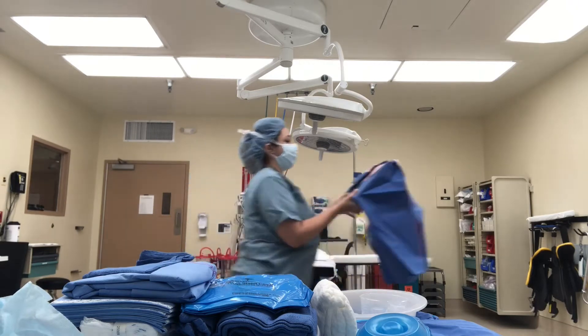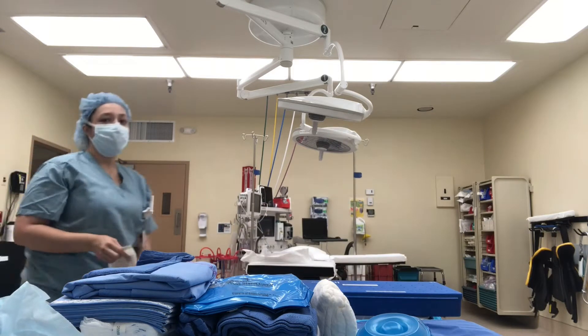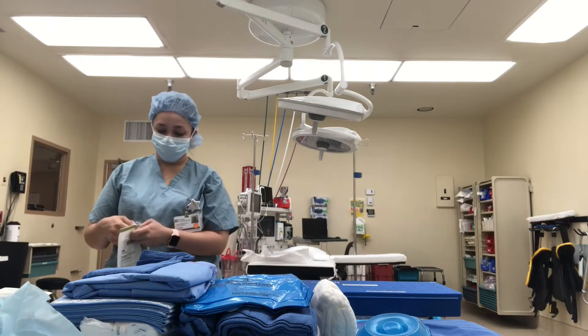Here I'm opening up my scope. Some doctors use more than one scope in some cases — this doctor is one of those doctors. And lastly, our gloves for both myself and the surgeon.